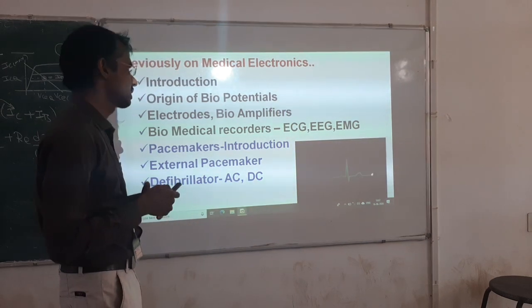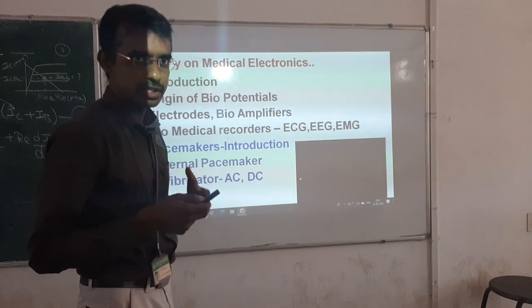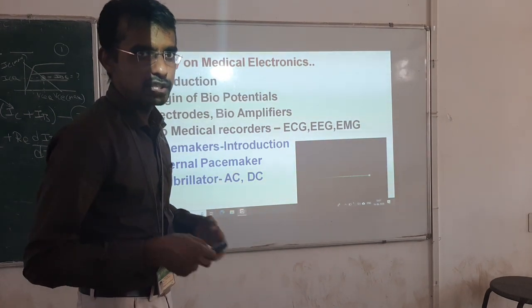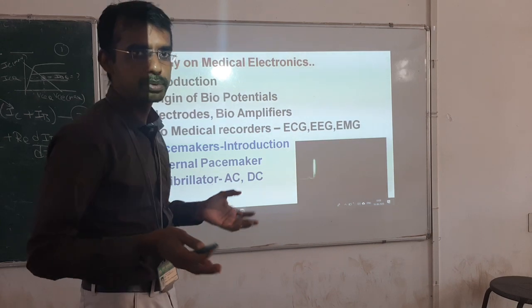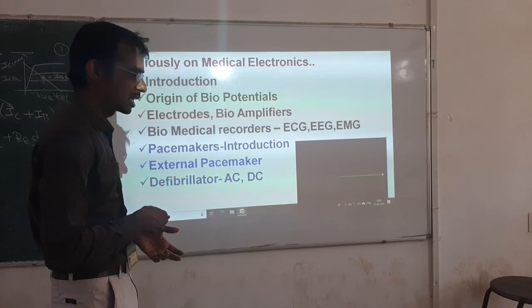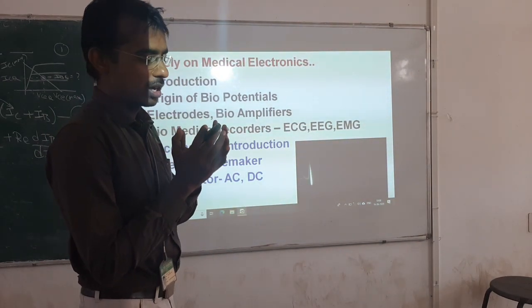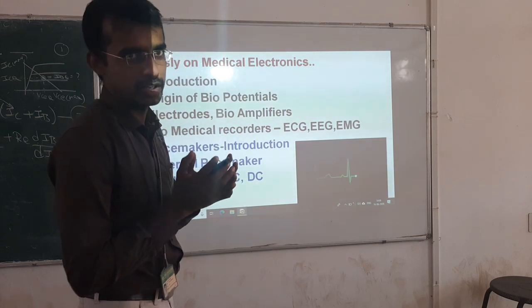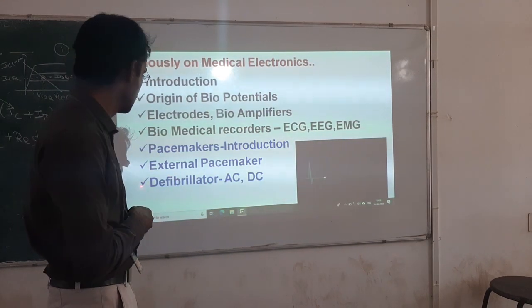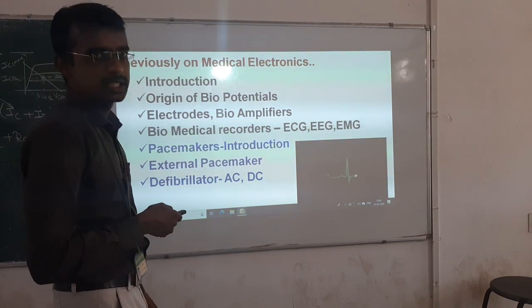Why is a defibrillator required, if you ask? Whenever there is a problem with the sinoatrial node, and that situation happens rarely, instead of going for pacemaking, we will try to provide a shock. That counteraction is called defibrillation. Generally, fibrillation means the heart will shiver or quiver to function. It will struggle to function. So to reset it, we make a counteraction, which is called defibrillation. The circuit which does it is called a defibrillator.